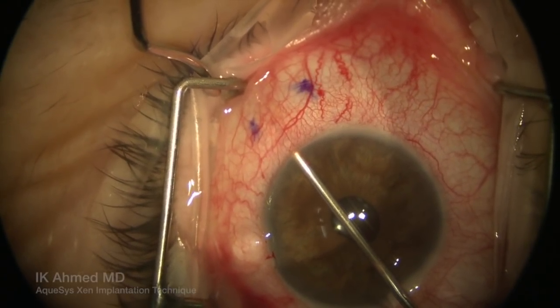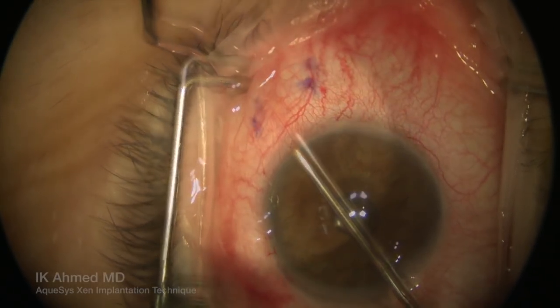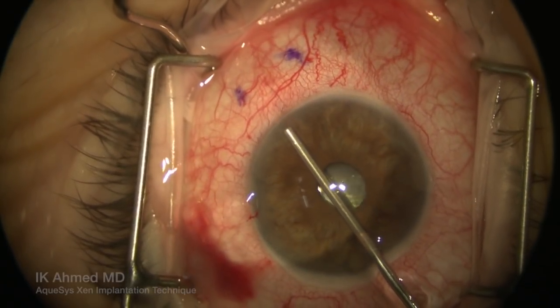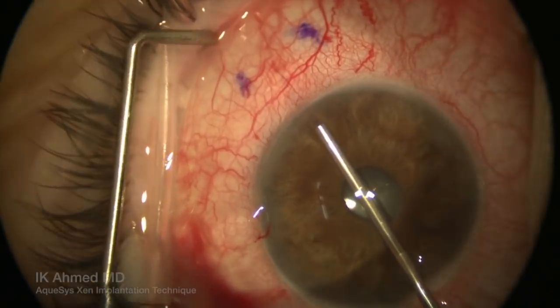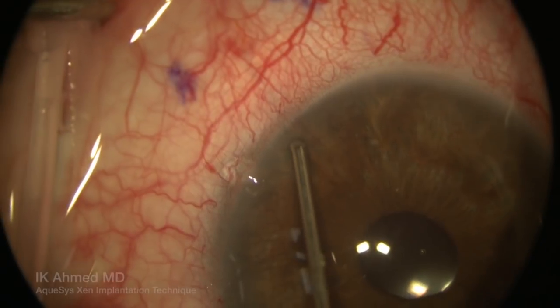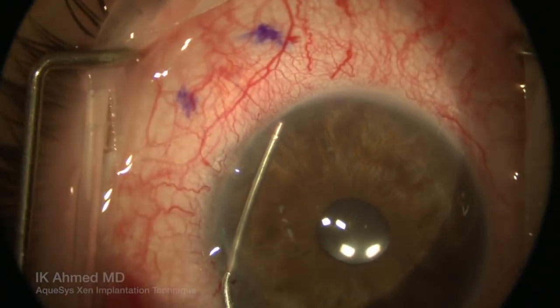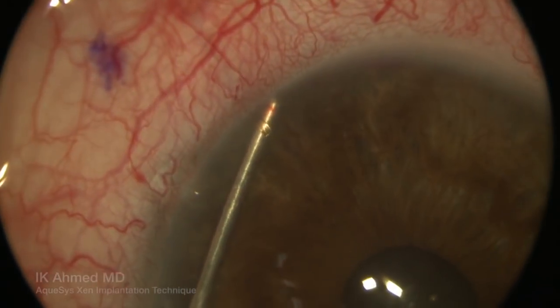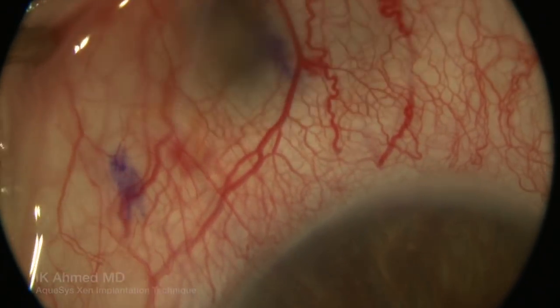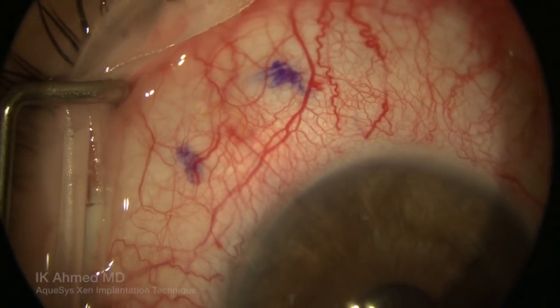It is important to keep the cannula in position against the angle to ensure adequate placement of the device into the subconjunctival space, intrascleral tunnel, as well as the anterior chamber. Here you'll see the position of the intracameral portion of the implant, visualized under the cannula, about a millimeter into the anterior chamber, positioned away from the cornea and parallel to the iris as we prefer it to be.